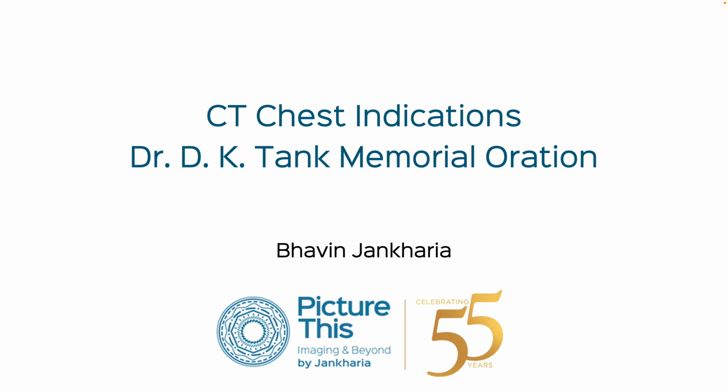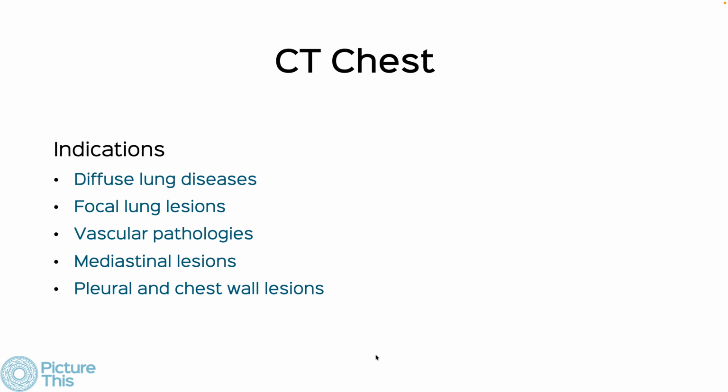This is a lecture on CT chest indications that I'm giving as a Dr. D.K. Tank Memorial Oration a little later in the day today. And I will be speaking about these 5 subjects and a little bit about each.